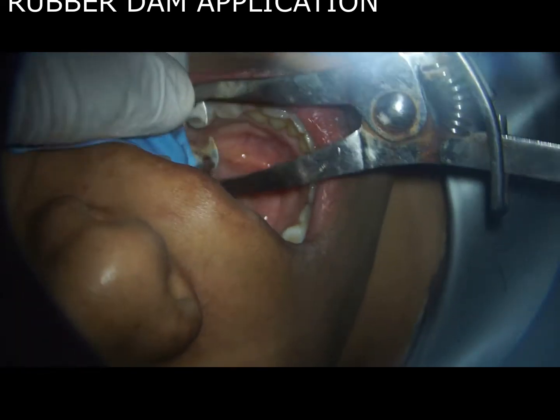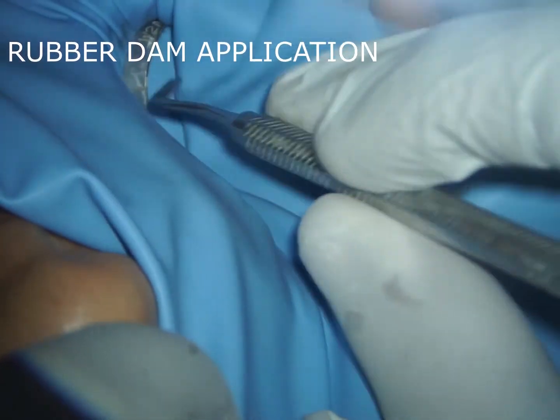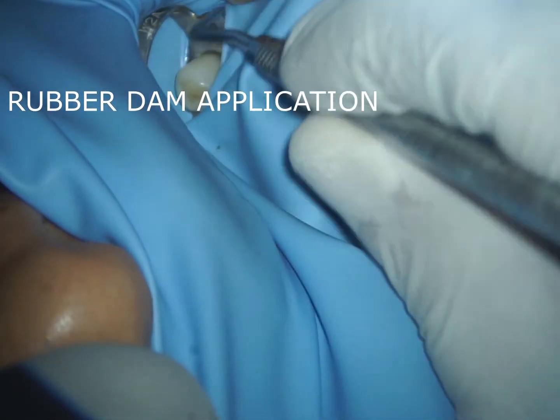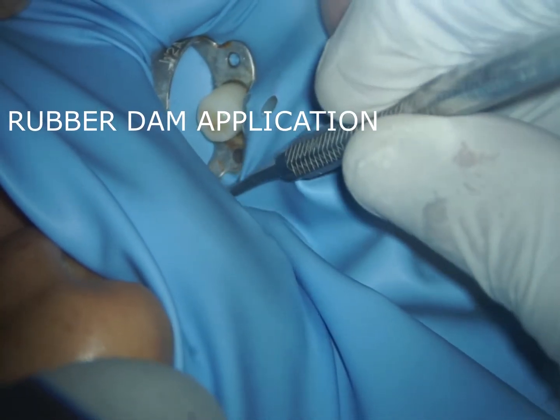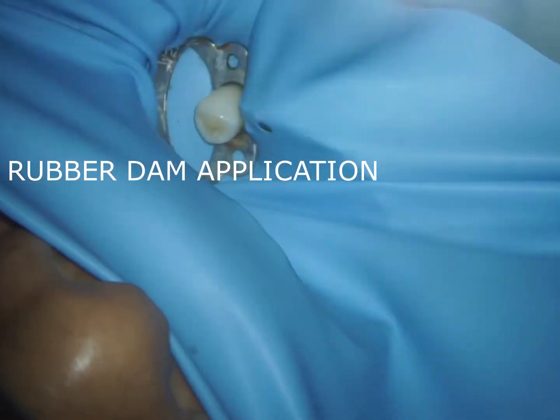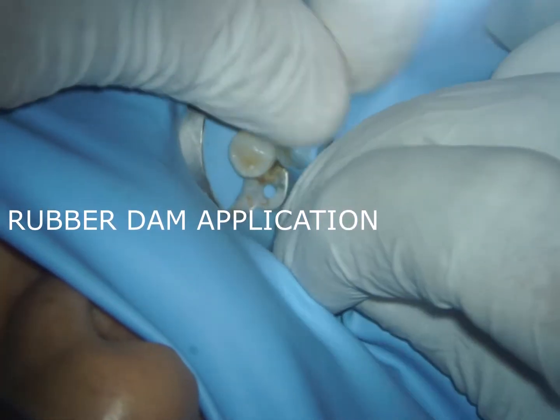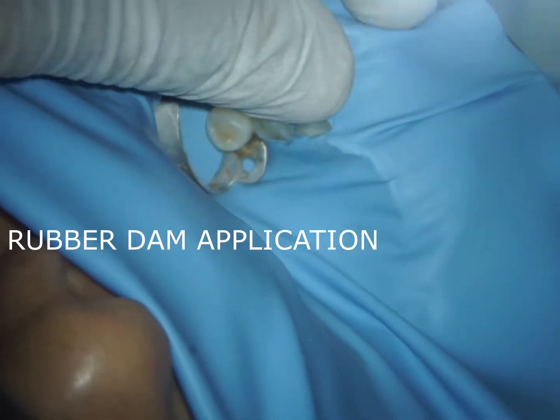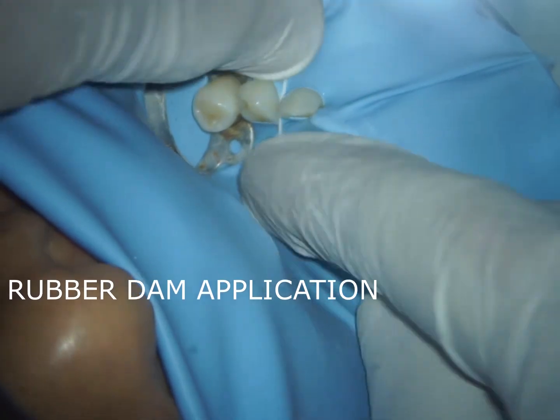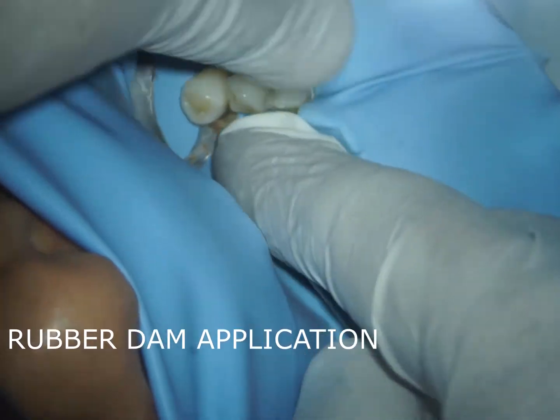This is a simultaneous technique to apply the rubber dam, in which the clamp, the rubber dam sheet, and the forcep go together. First we place the clamp on the tooth, then take the rubber dam sheet beneath the wings of the clamp, stretch the sheet and fix it to the frame, then use floss to take the rubber dam sheet through the interdental contacts. We generally try to isolate more than one tooth when attempting the root canal.